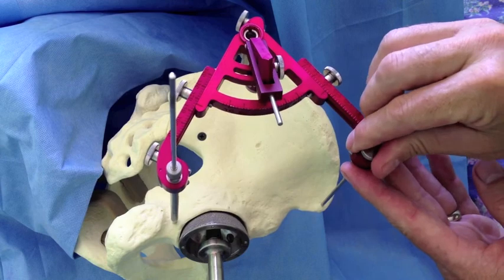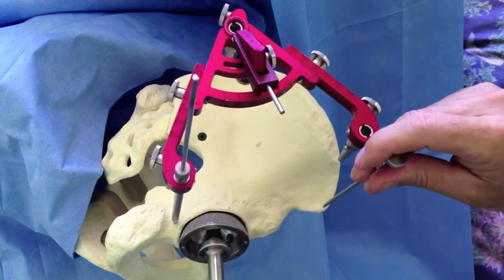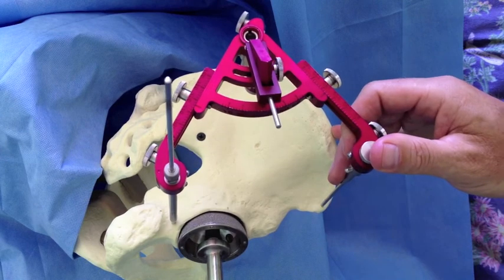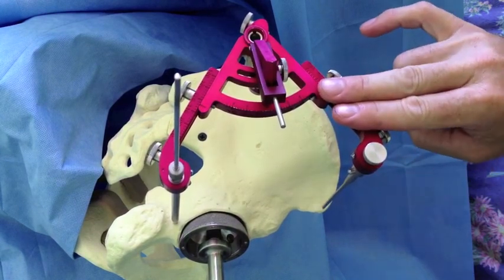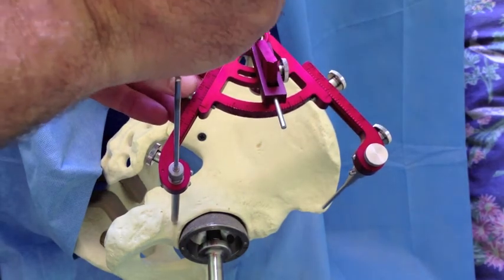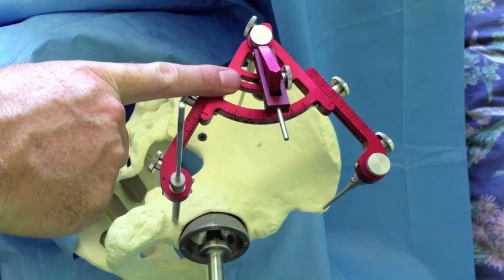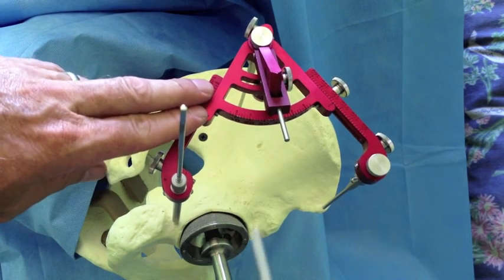If you have trouble identifying this location, you can remove the trocar from the cannula and use it as a freehand probe instead. Once you are sure that you are docked on the bone just back from the edge of the ASIS, hold this position. The second trocar is then inserted through the apical cannula and locked into position. The instrument finds this location automatically. In navigation terms, the pelvis is now registered and is being tracked by the instrument.